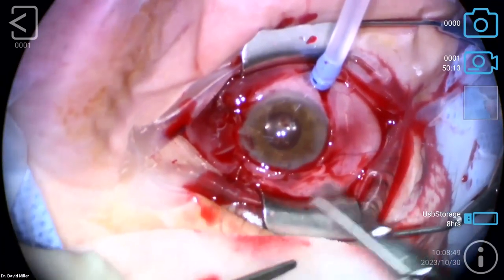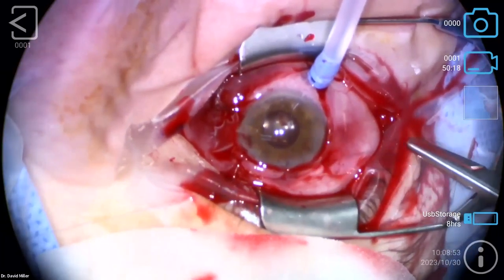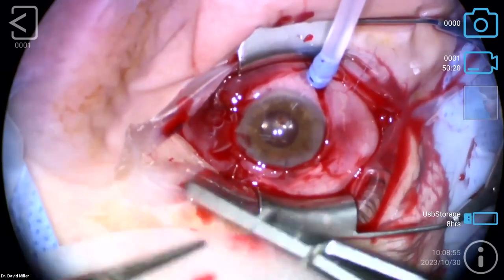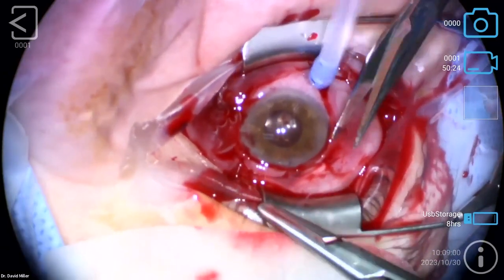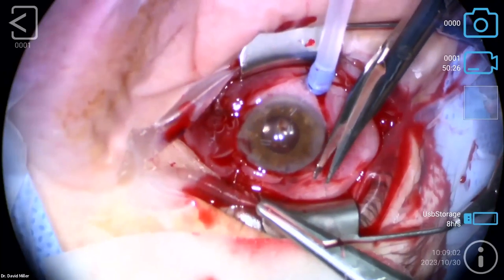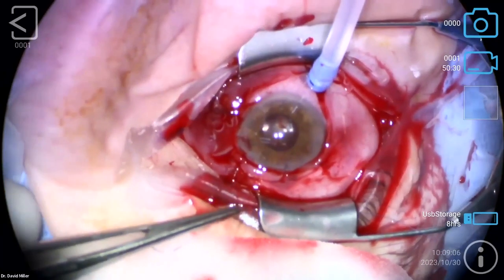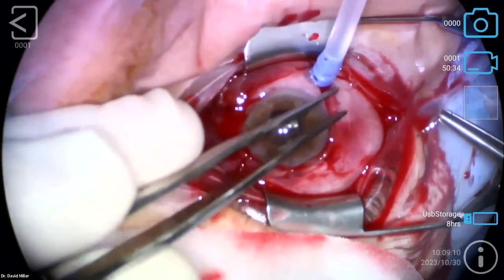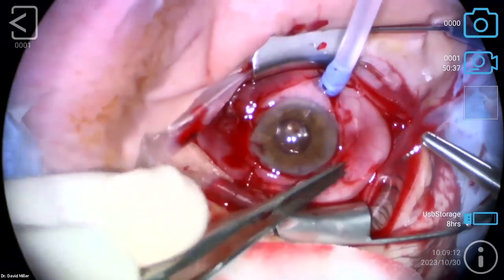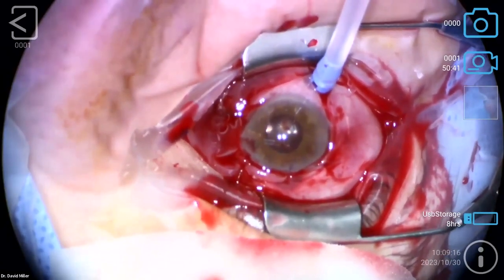So a couple of things. One is when you're doing this case, you have to have the lens implant that's already in the eye, you know, so you can either do a conversion and calculate what this Acrysof's power should be, or you can have the patient remeasured with biometry. So A-scan, IOL Master, or whatever your preference is. This one we'll probably put in after we pull the cannula there. A little long, see if you can trim that for me. You got a Q-tip, Mike?